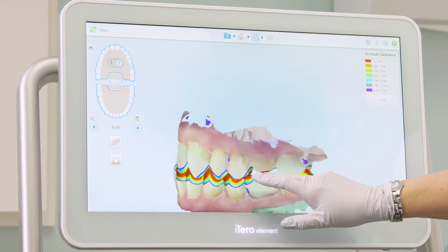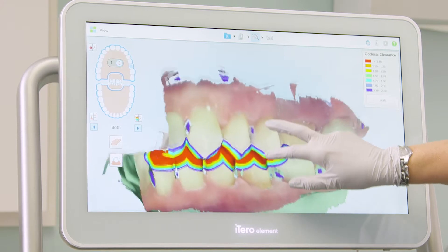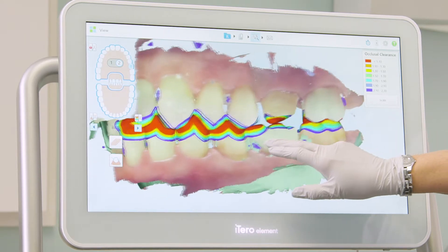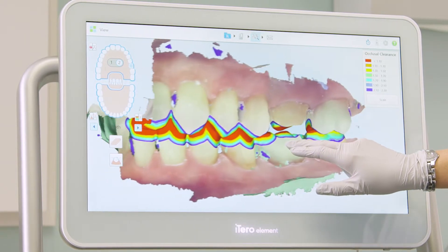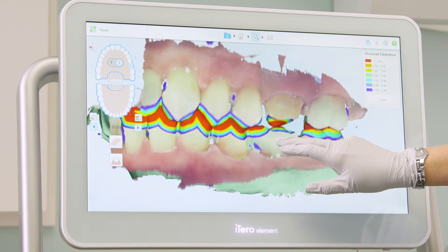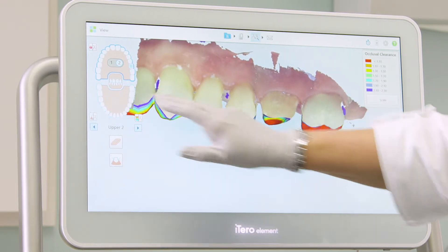Using the color map, I see that I do not have adequate clearance, so I will adjust the prep in the patient's mouth and then use the eraser tool to adjust the digital model.